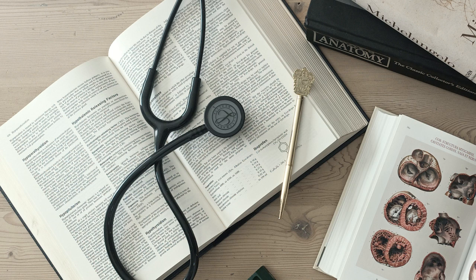On the ECG, you'll always have a widened QRS complex, again greater than 0.12 seconds. A truly characteristic pattern, the one everyone learns, is the RSR pattern, often described as rabbit ears, particularly noticeable in the right precordial leads, V1 and V2. RSR in V1, V2, rabbit ears.